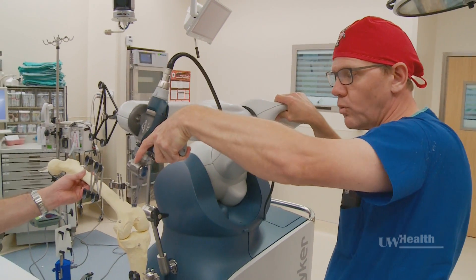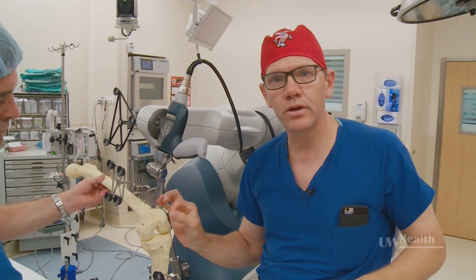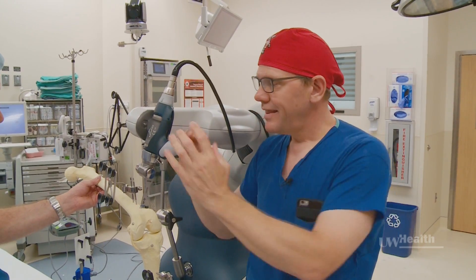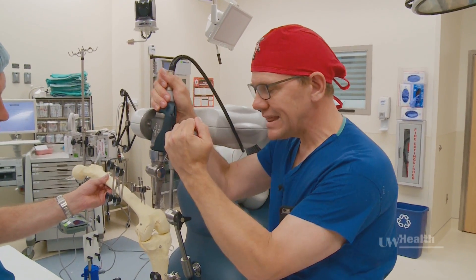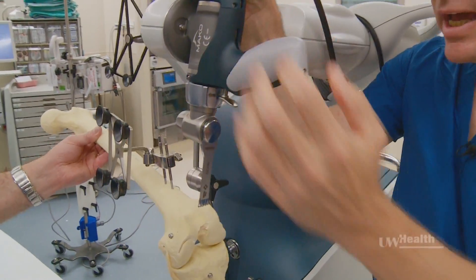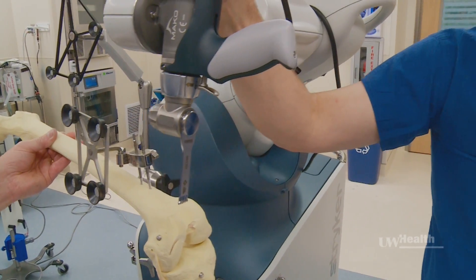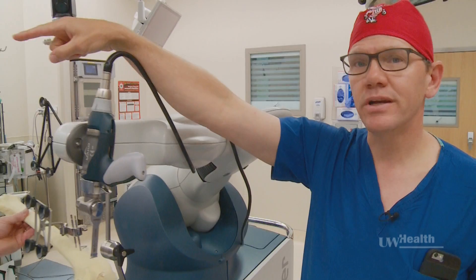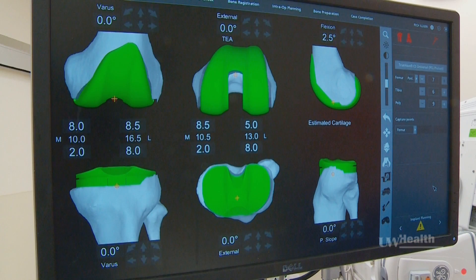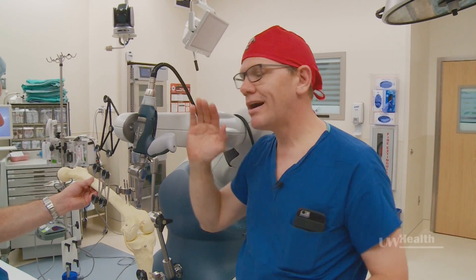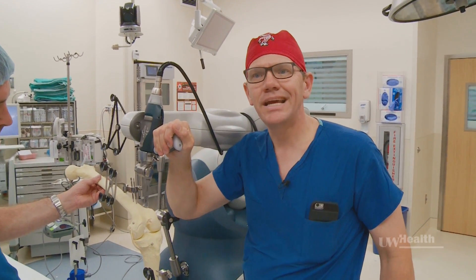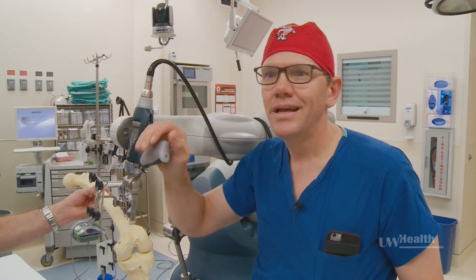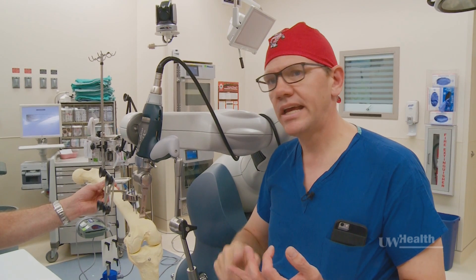So now when I want to cut exactly eight millimeters of bone from the end of the femur, this will literally lock into the right position and will only allow me to remove the bone I planned on removing, as you can see on our three-dimensional plan preoperatively. All the different cuts are now driven by CT guided robotic assisted bone preparation instead of using eyes, hands, experience, and two-dimensional images.